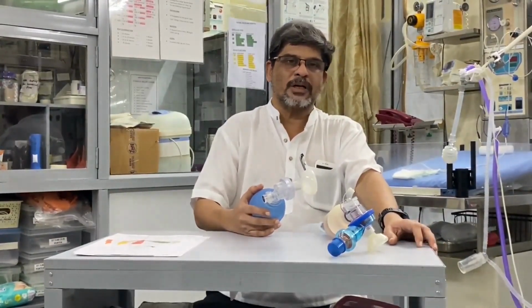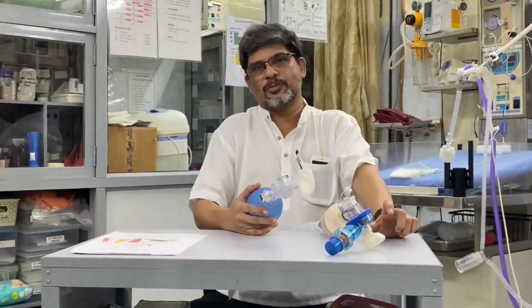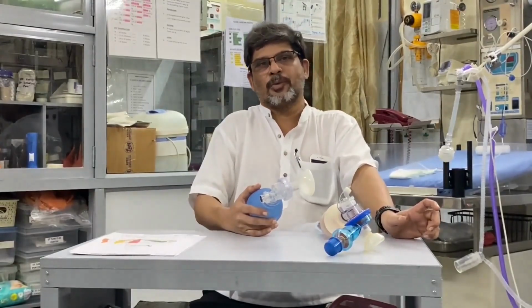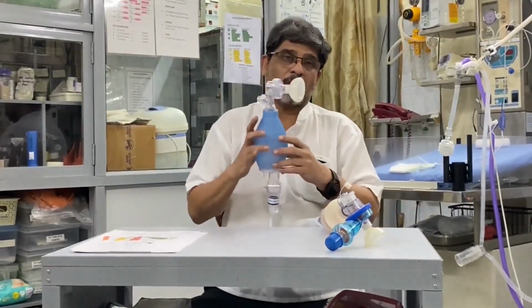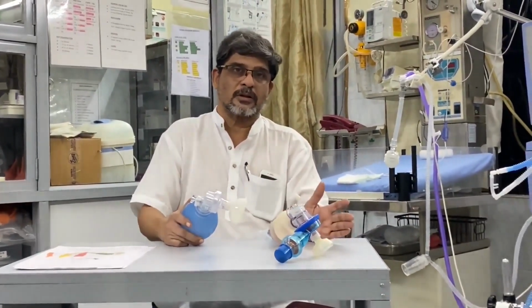Our brain determines how many times we breathe, how much time should be given for inspiration and expiration, and what negative pressure should be raised in the chest. As far as a bag and mask or a ventilator is concerned, the process is exactly reverse.